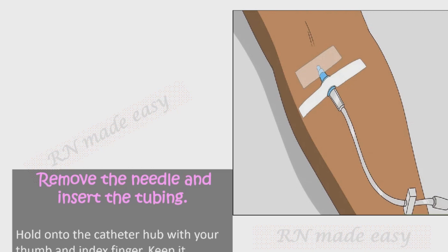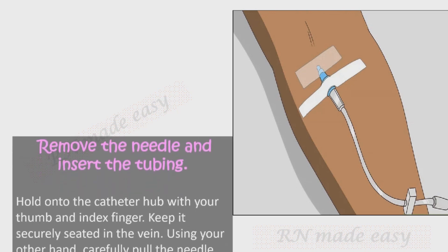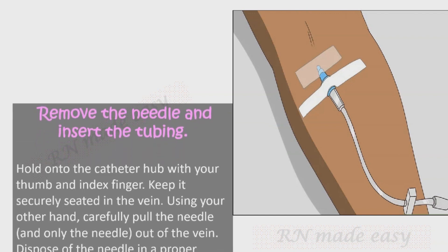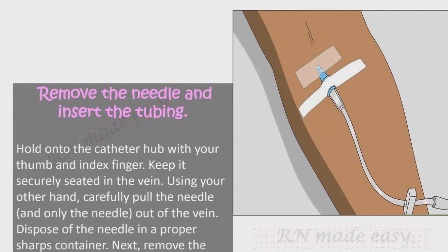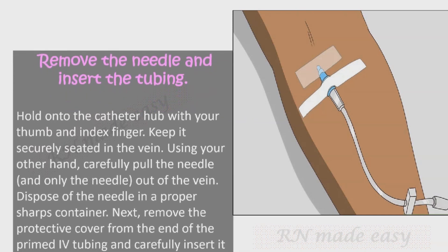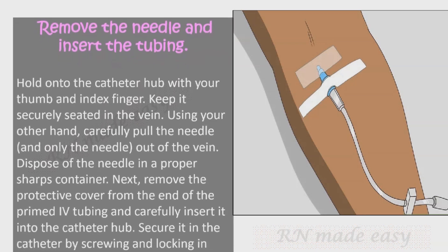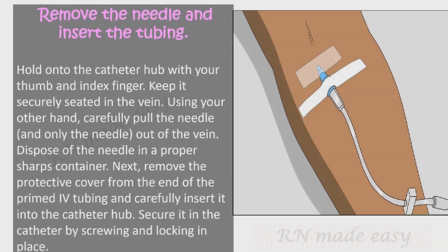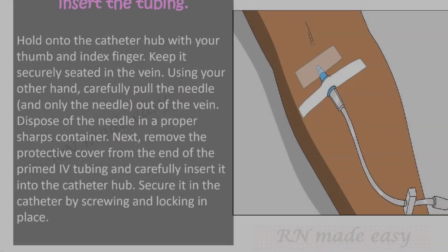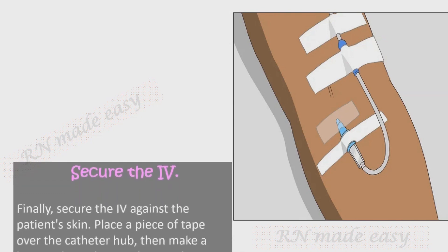Remove the needle and insert the tubing. Hold onto the catheter hub with your thumb and index finger to keep it securely seated in the vein, then carefully pull only the needle out of the vein and dispose of it in a proper sharps container. Next, remove the protective cover from the end of the primed IV tubing and carefully insert it into the catheter hub, securing it by screwing and locking in place.